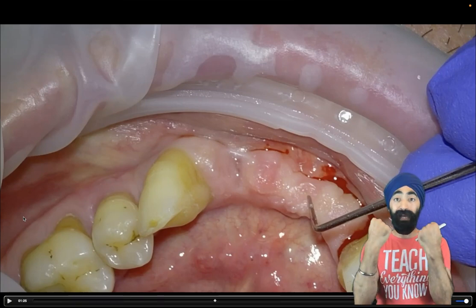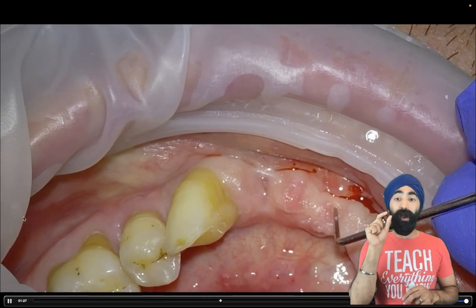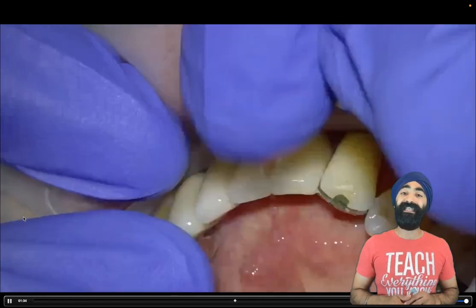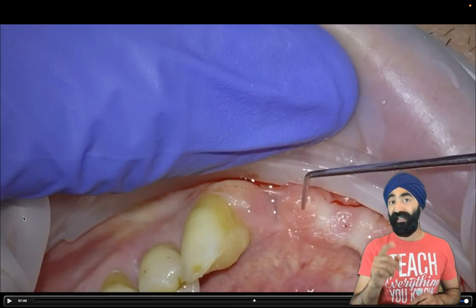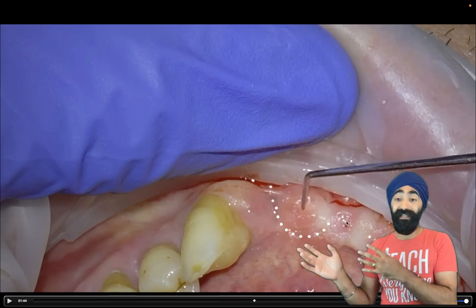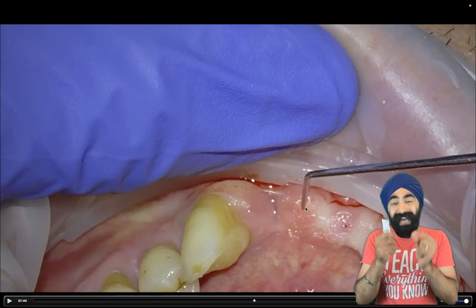Because I don't want the soft tissues to rebound and put my resin cement under stress, I'm going to anesthetize the patient and identify the areas where the pontic is sitting. If you're not sure the first time you're doing this, just try the bridge in again and press it on to see exactly where you need to adjust. You'll notice the blanching of the tissue. Now, logic would make you think that it's where it's blanched that you need to adjust — but actually that's not the case. You actually need to adjust in the region where it's not so blanched, where you see a nice little imprint of the pontic. If ever in doubt, just place the bridge and identify for yourself exactly where you need to adjust.